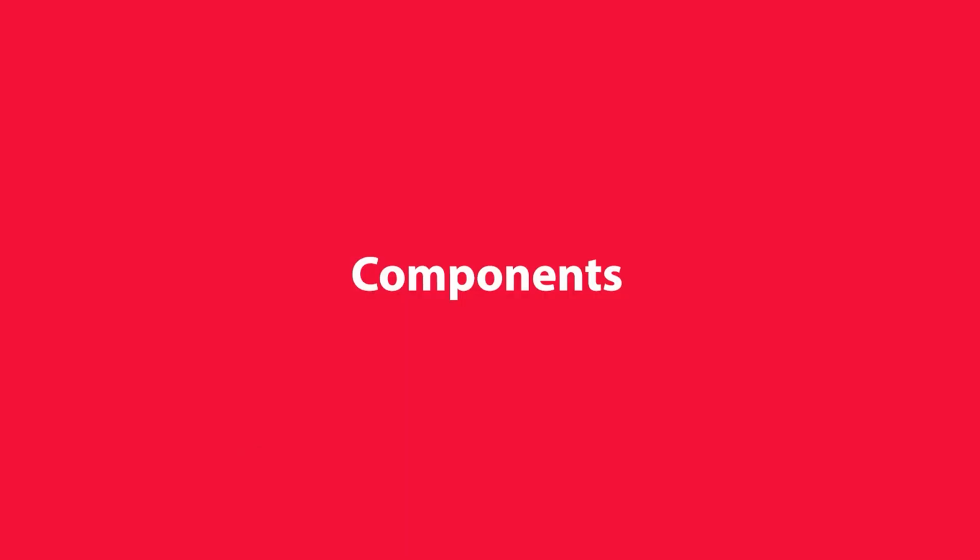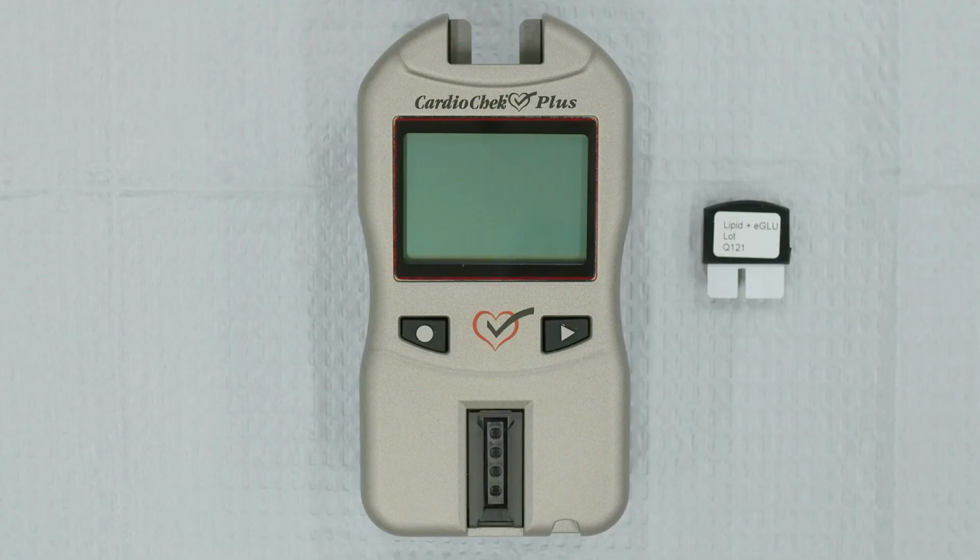Let's go over the components of your CardioChek Plus analyzer. The display shows test results, messages, the time, the date, and stored results. The Enter button allows you to turn the analyzer on and accept menu choices. The Next button also allows you to turn the analyzer on and advance to the next menu option. The Memo Chip port is where you'll insert the memo chip that comes with your PTS Panels test strips.